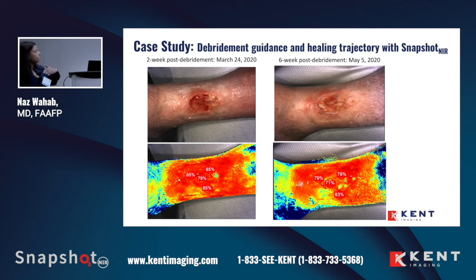Also, to understand your healing trajectory, I think that's important as well. I utilize this. We have insurance contracts, right? And they want to talk to me every month about their patients and why their patients are not getting better or that they're getting better. So I pull up a lot of these images to give them hard data, not just a pretty picture, because a pretty picture can be given by anybody, but really to give them hard data that no, this is a very tough case.